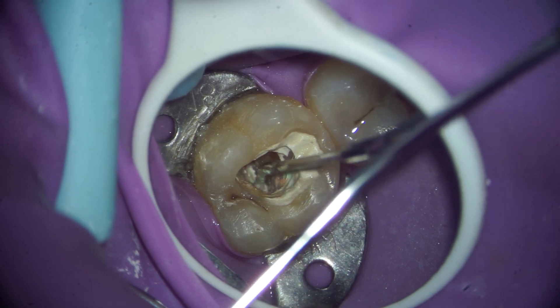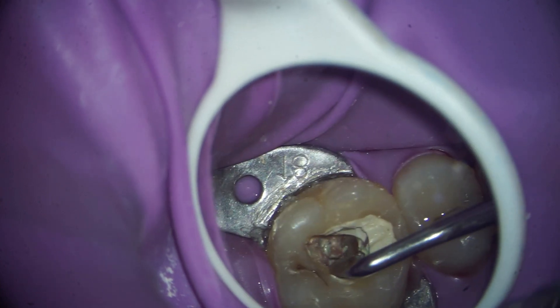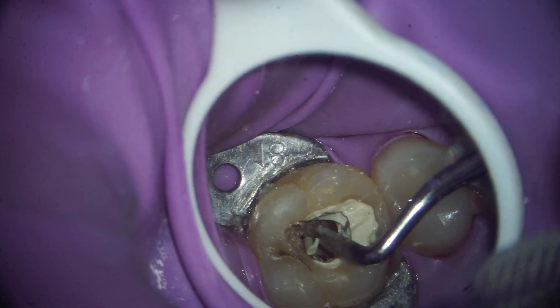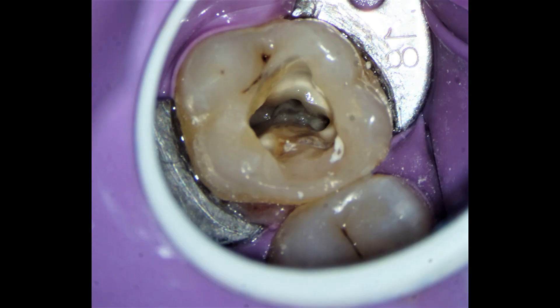What has happened is that the root canal system has been inadequately cleaned. So first and foremost, we need to remove all the obstacles in the root canal system so that we can clean it. After the first sitting, we removed all the obstacles, cleaned all the canals, negotiated the ledges, reached the apex in all three canals, and thoroughly irrigated everything with sodium hypochlorite solution. The patient was almost asymptomatic after three to four days.